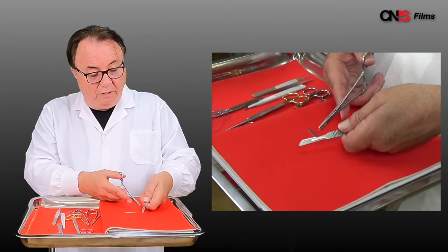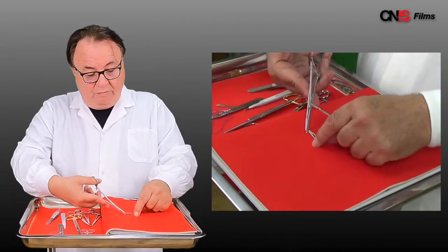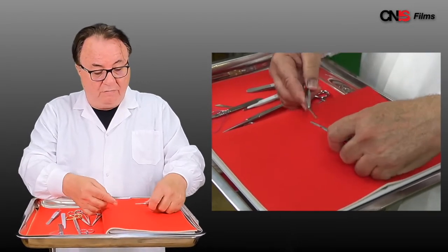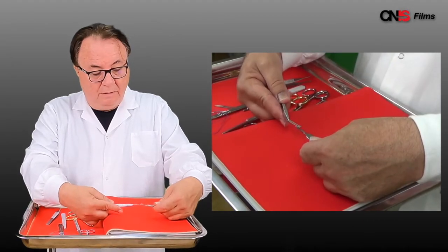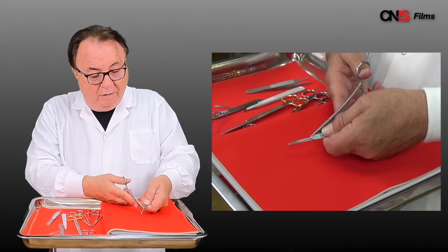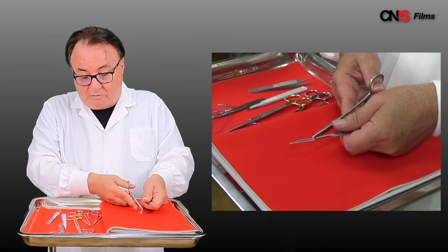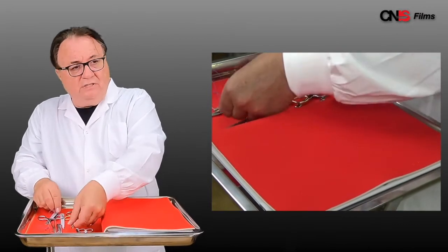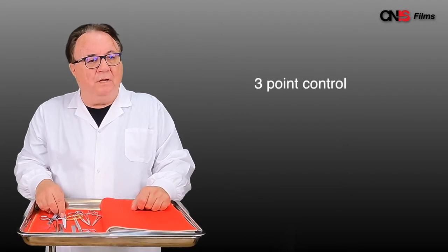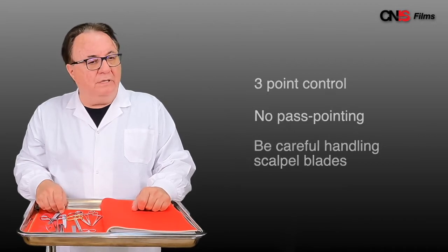When you want to remove it, you turn it over, grasp it and it slips off. Let's review this with the number 15 blade. Again, cover the blade so you don't hurt yourself. Line up the bevels. Slip it on. After you finish the procedure, turn it over, take it off in the opposite direction from yourself so that you're not cutting yourself. So this is the basis of handling instruments: three-point control, no past pointing, and make sure you're careful when removing or putting on scalpel blades.